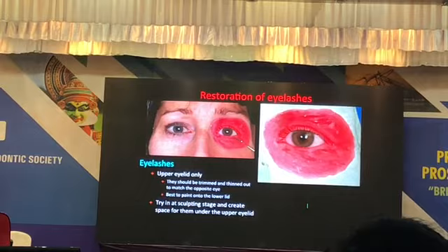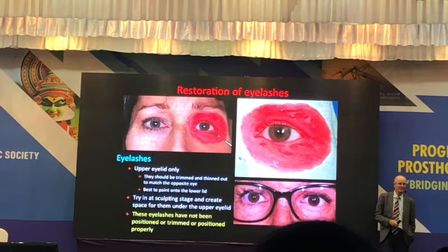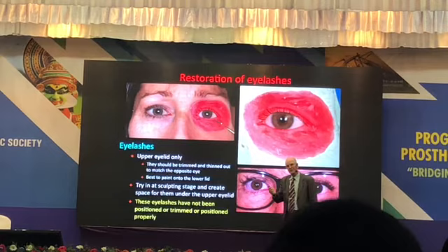So look at this. See, they haven't been thinned properly. So it's a nice prosthesis. Everything looks great, except the eyelashes are not perfect. They have to be thinned out. And you'll notice that all the ladies know about eyelashes, the guys don't.